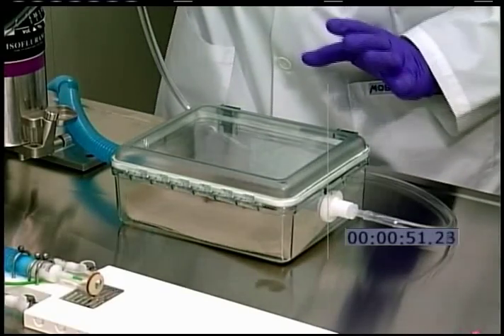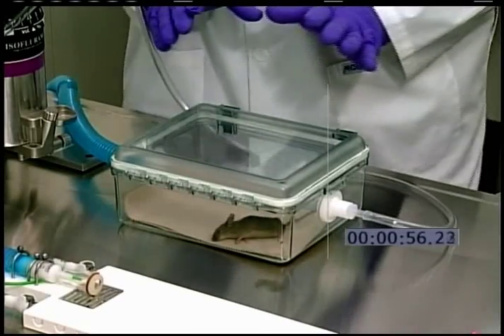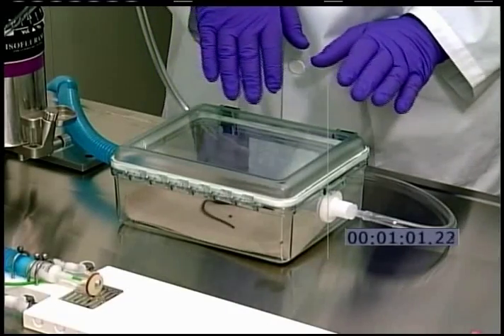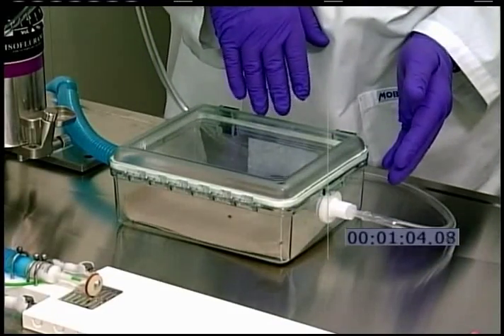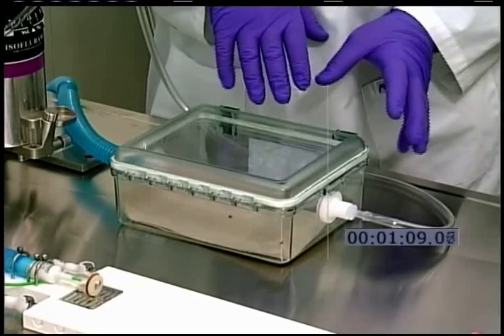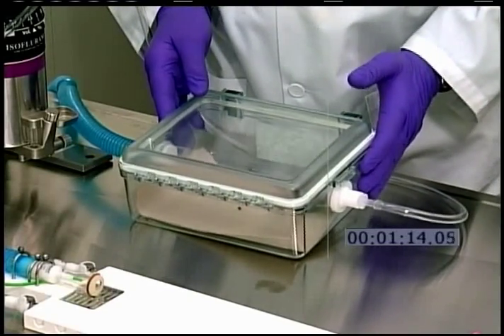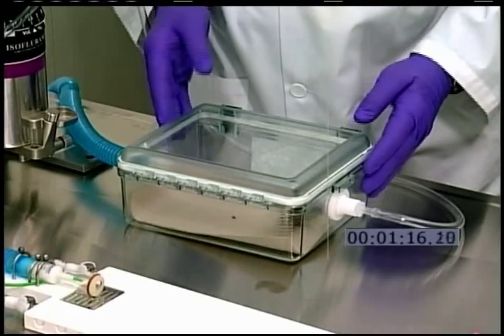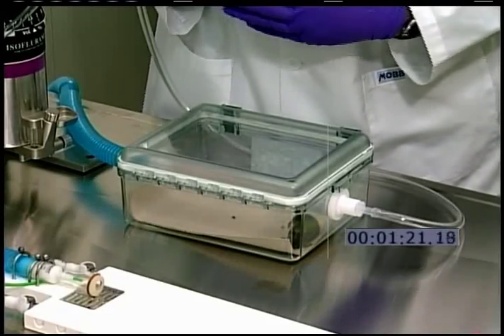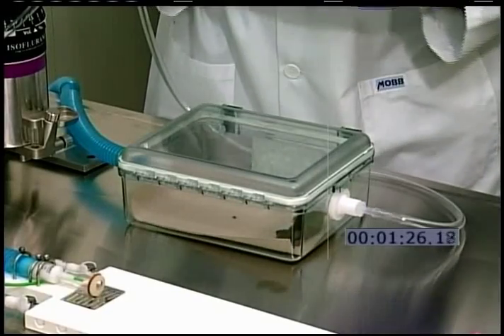And I'm going to turn him down now to the 2.5% level and allow him to equilibrate. You can see he's kind of like some folks we see coming out of a bar on Saturday night, late at night, and he's in that excitation phase right there a little bit. But as soon as he loses his righting reflex and he stops his movement, we can consider that he is beginning to become anesthetized.